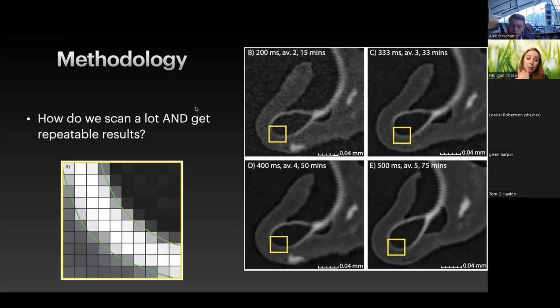And so on the bottom left, you're seeing the representation of the flexible area that we might have. The bright white area is going to be the shell that we're confident about. As it gets dimmer or darker gray, it's areas that may contain shell, but they also may not. It has to be broken up into these squares. And so, could we say that the slightly darker gray is only, let's say, 25% covered by shell, or is it just too unreliable to be able to assign shell or not shell?